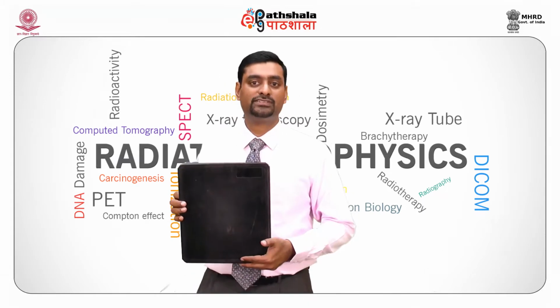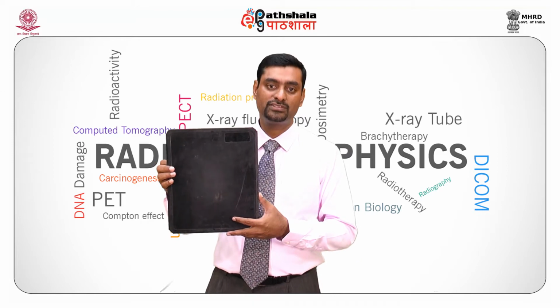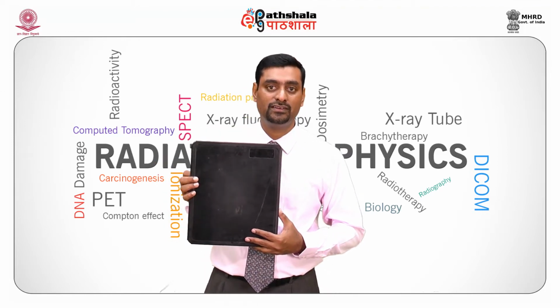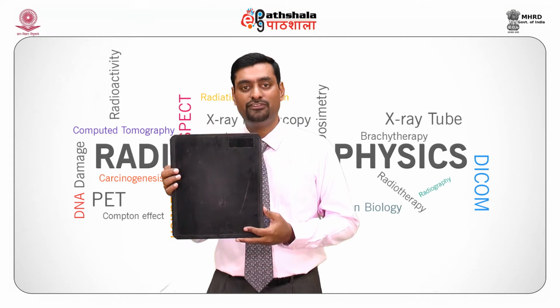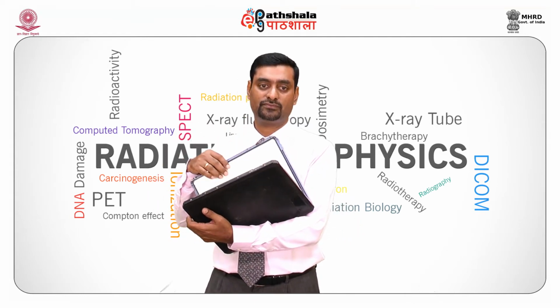Let's move on to a conventional film screen cassette. What I am holding here is a conventional film screen cassette. A cassette is a light tight box which keeps ambient light from exposing the film. The film is placed inside this cassette.